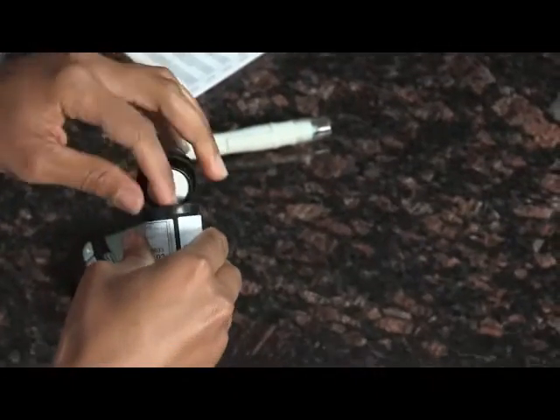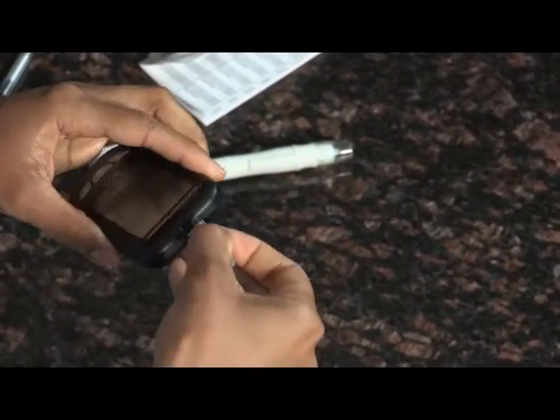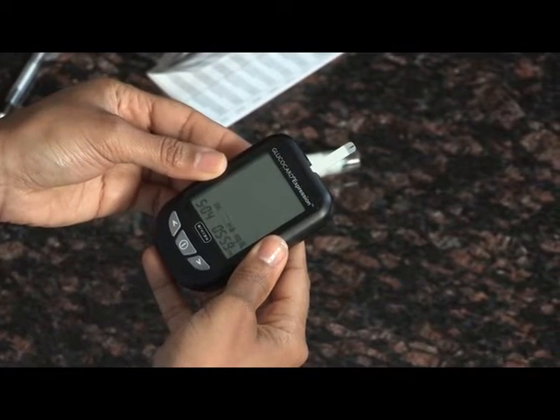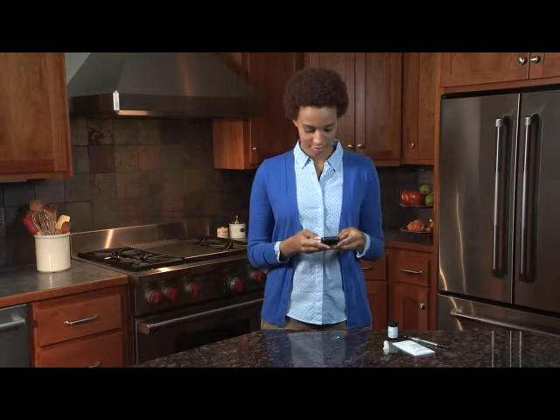To begin, remove a Glucocard Expression Test Strip from the test strip bottle. Close the cap immediately and insert the test strip to turn the meter on. A flashing blood drop and arrow icon appears on the meter display screen. The meter will announce, "Please apply blood onto the test strip," if you have the voice feature turned on.